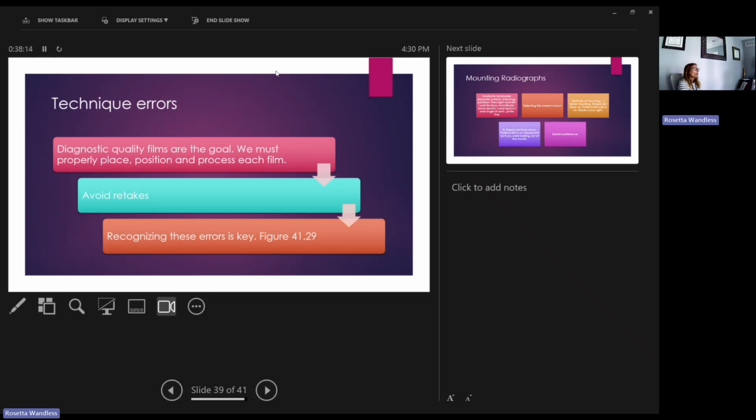Even though we can use a panoramic, a lot of times we really can't see decay clearly on a pan, so we may need to mix in some bite wings in order to see contacts where that decay would show. So there are some panoramic imaging machines that can grab a bite wing, so you can have an idea if we cannot get any bite wings whatsoever.